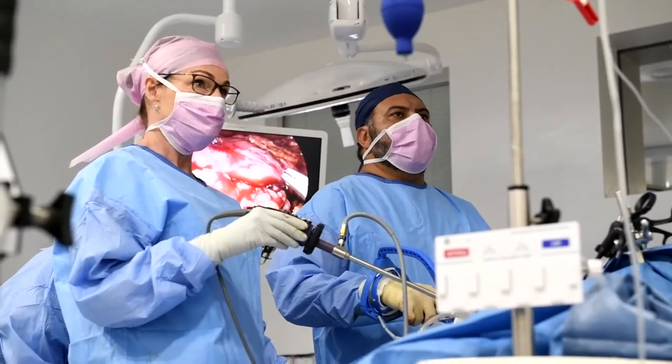That allows you to be very precise with placing sutures, with handling tissue and handling thread, for example, which is very fine and allows you to achieve actions at angles that you wouldn't be able to achieve using straight stick laparoscopy.